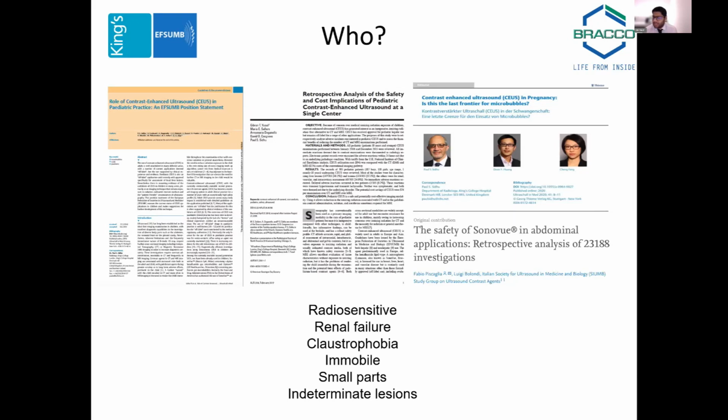The patients who are immobile, let's not forget, there are patients who come into A&E who are too sick to come to the department. There are patients who are too sick to move from ITU. There's an impracticality about bringing a whole load of things down. Potentially, if you're going to an MRI scan and maybe you've got magnetic parts and metallic parts that you can't take in there. There are other parts of the body you can't examine with anything else, and there are also the second line investigations for focal lesions.